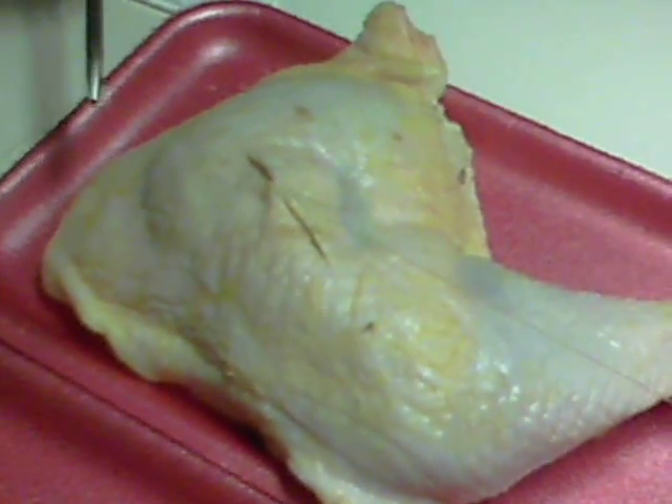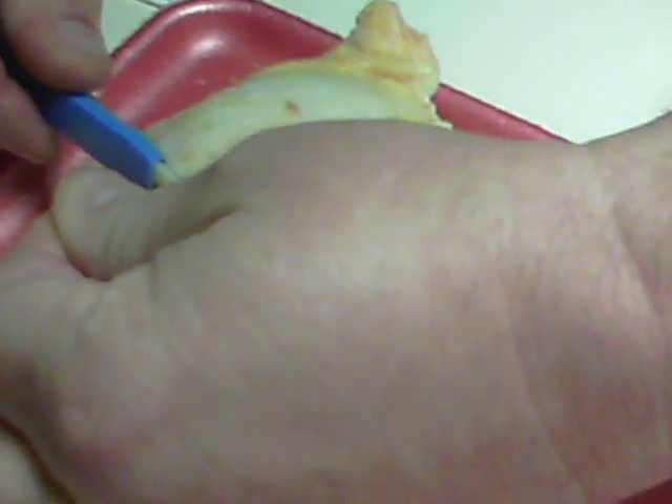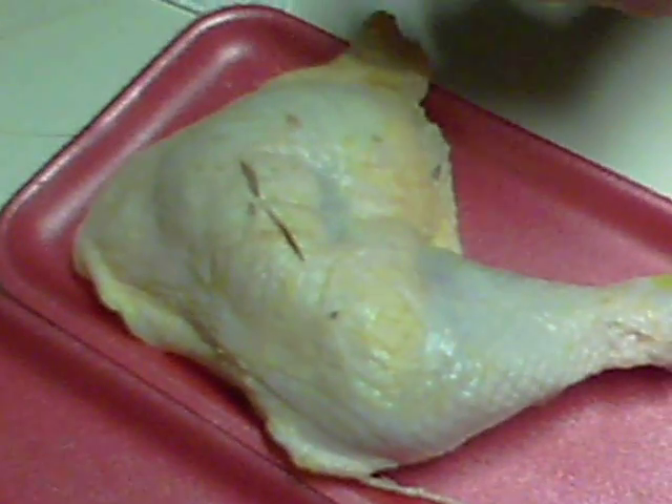So then you go like this. Then you'd have scissors and you'd cut those off, right like that. So who's the next victim? Come on up here — the chicken is the actual victim. Go ahead, just carry on.